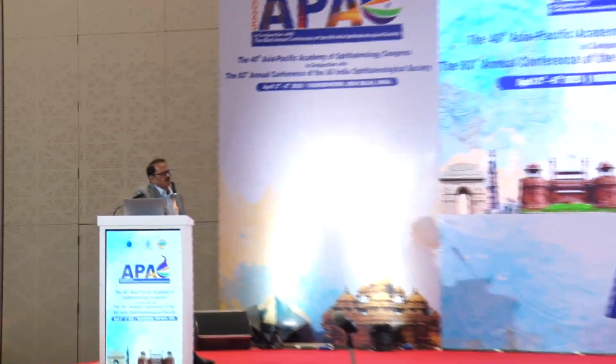Sir, actually, we expect that there will be some amount of refractive surprise. By definition, refractive surprise is told once you have 0.75 diopter of astigmatism after surgery and 1 diopter of spherical after surgery. So, I could not get your question.